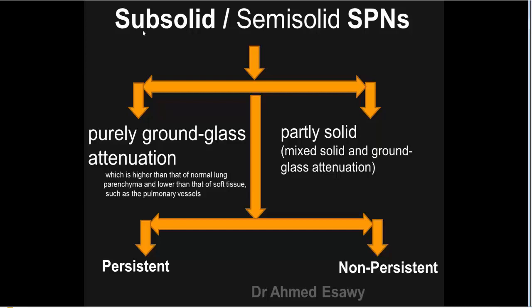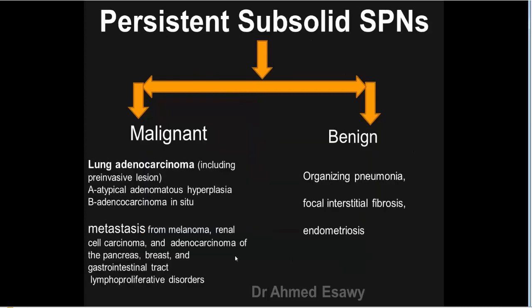Subsolid, semi-solid solitary pulmonary nodules are divided into persistent or non-persistent.